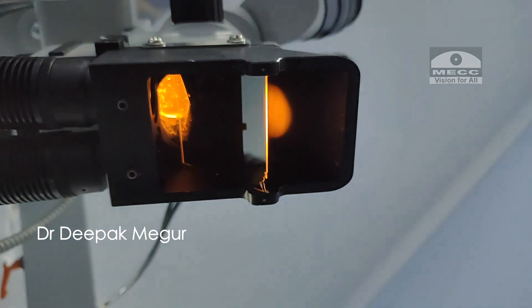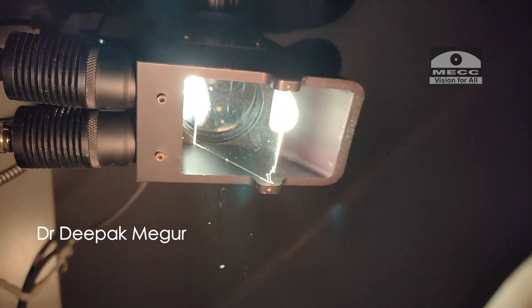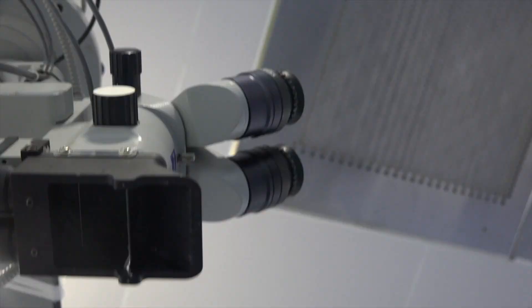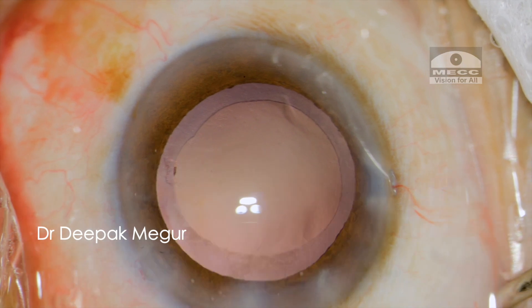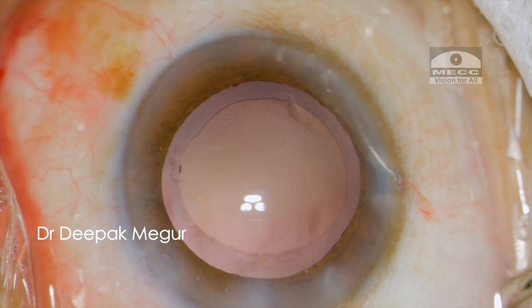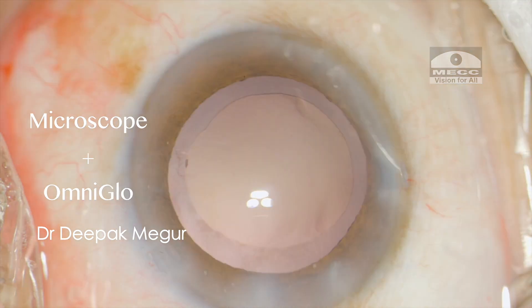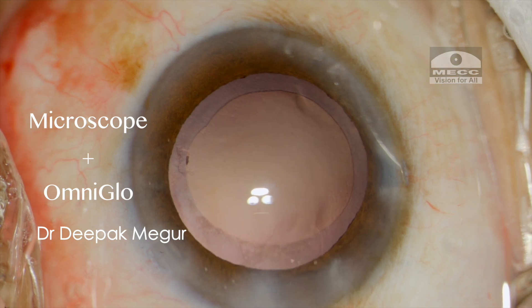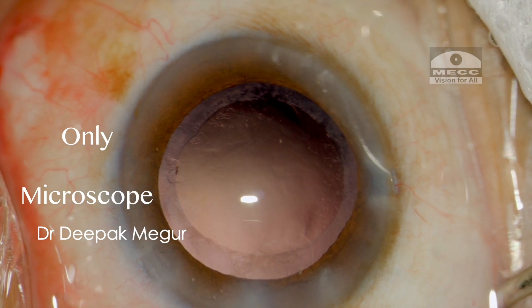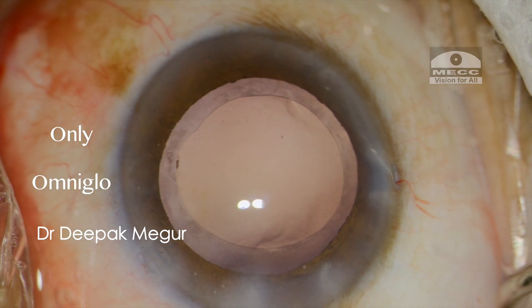So what has been my experience with it? For a surgeon who does not have stereo coaxial illumination in their microscope, this would be a brilliant addition — we get a fantastic red glow at every stage of surgery irrespective of pupil size. Let me demonstrate the light settings. The top broad light belongs to the microscope, and the bottom two lights are coming from the Omniglow. We see three light reflections when both the microscope and the Omniglow are on. This is how it looks with only the microscope light on, and this is how it looks with only the Omniglow on and the microscope light turned off.